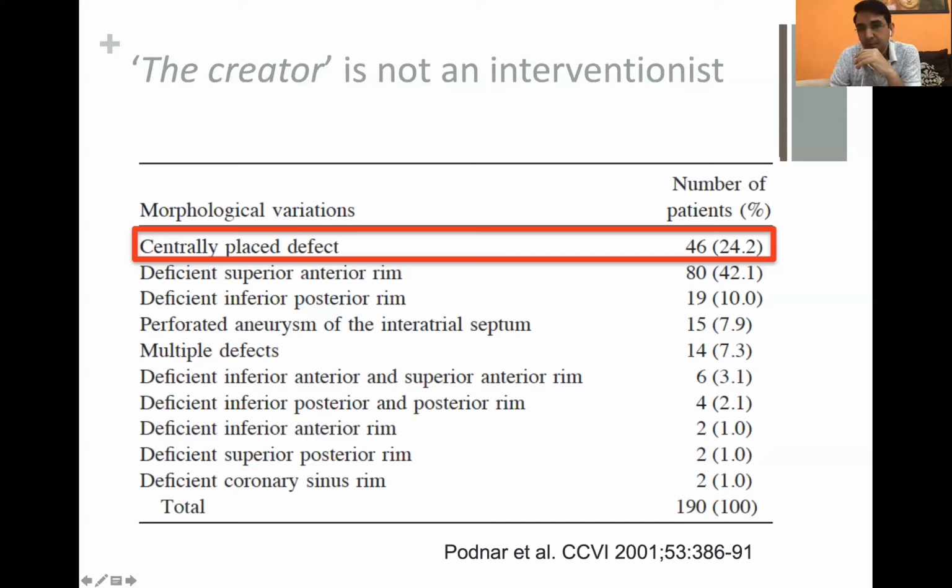Another question that has come up from Arun Bableshwar is, there was one of your videos that was showing a device prolapse, and he was asking why it prolapsed and which rim was absent. What we could see from that image was that the retroaortic rim was deficient. But any updates on that particular case?